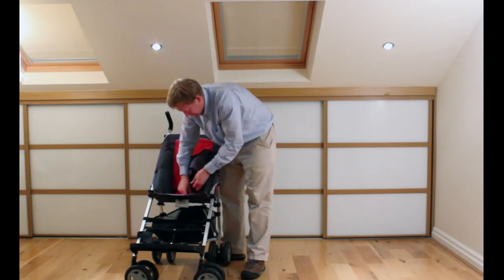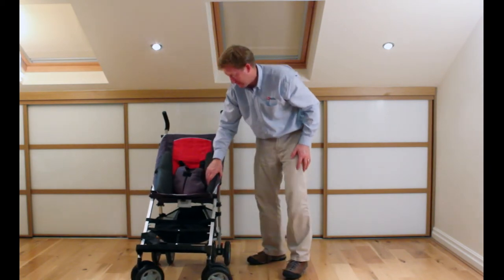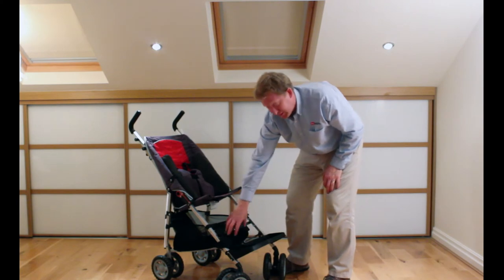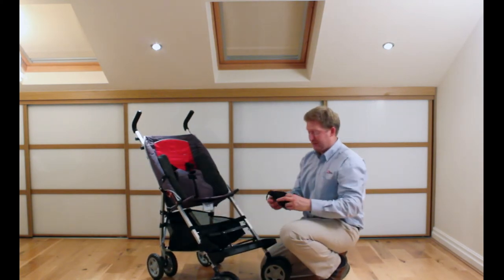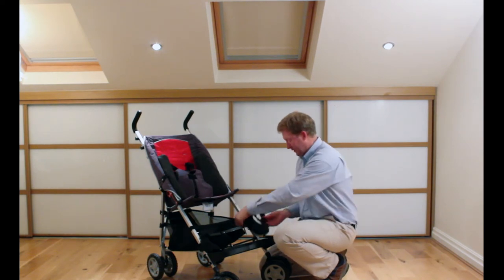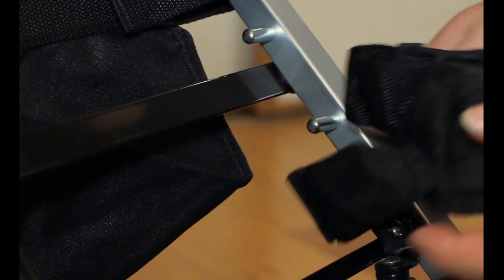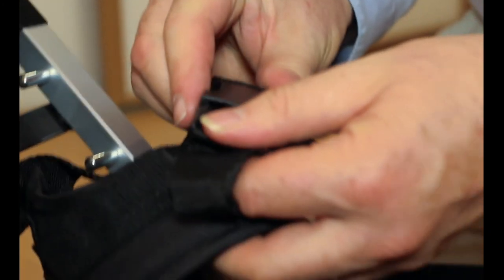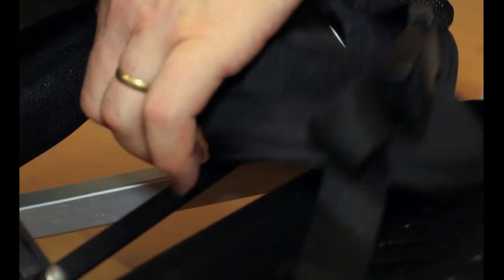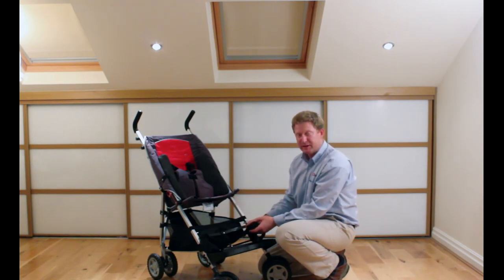You then clip them in at the lower section. The ankle huggers attach to the frame down below — I've just attached one there. It's a velcro strap that goes around the frame and holds them on, then there's a clip. When you've got their foot in place you clip it and their feet should be secure. You tighten it depending on the tension needed to keep it comfortable, just to stop their legs getting thrown out to the side if they tend to kick.